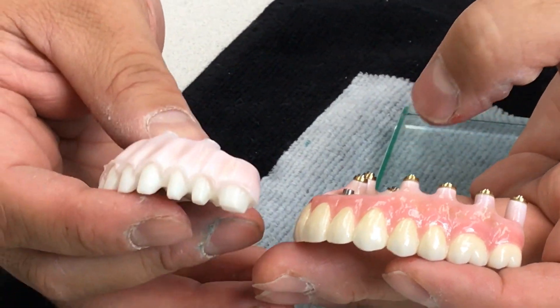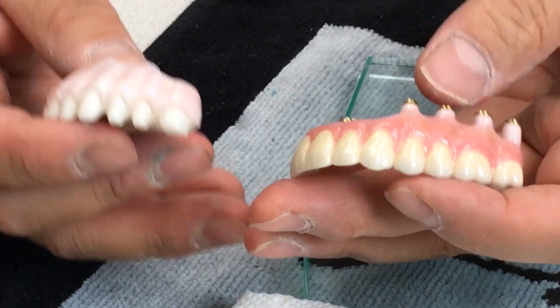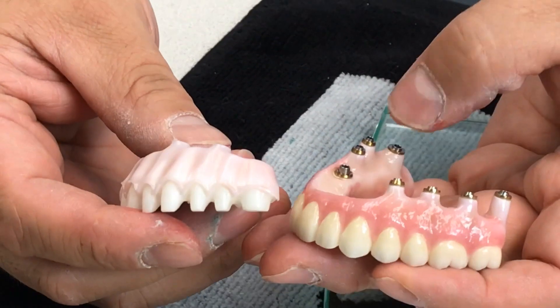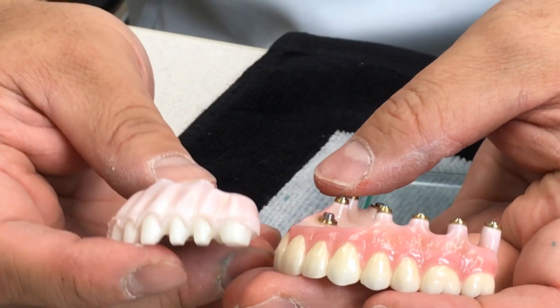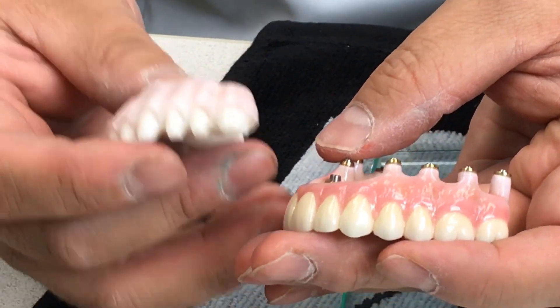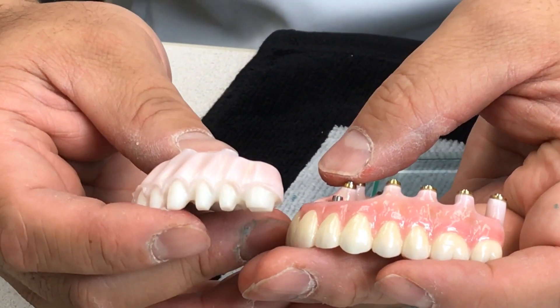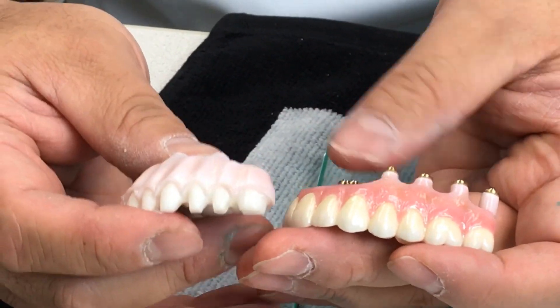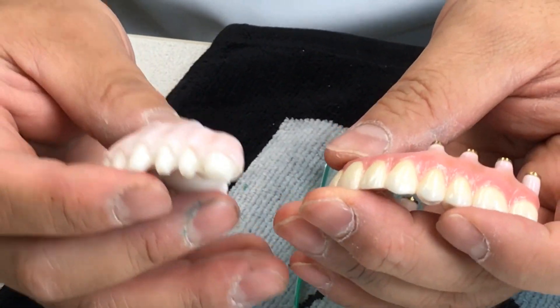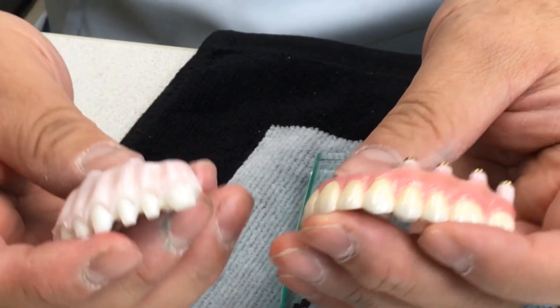This is the 31 millimeter full arch implant case. We always have an issue with cases 31 millimeters or longer, and when you have an implant case you sometimes bump into this kind of problem. Today I'd like to explain what I did and how to create these 31 millimeter longer implant cases.